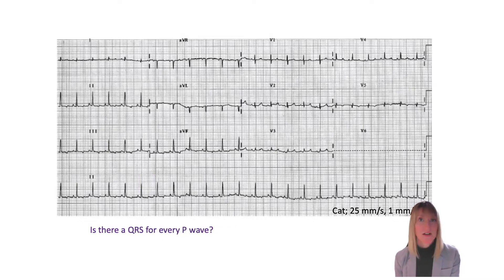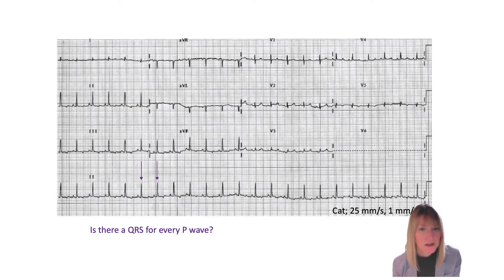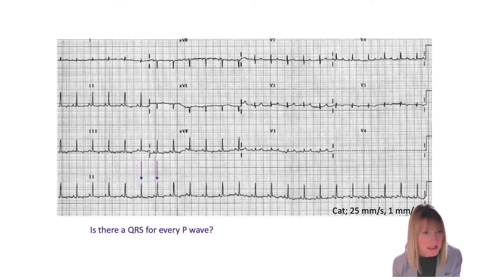My next question is, conversely, is there a QRS for every P wave? So now I'm focused on the QRS complexes — I've identified them there. As I scan left to right across my ECG, I'm really focusing on lead two here, though we could be looking in any lead for the purpose of this exercise. Is there a QRS for every P? Yes, indeed there is.